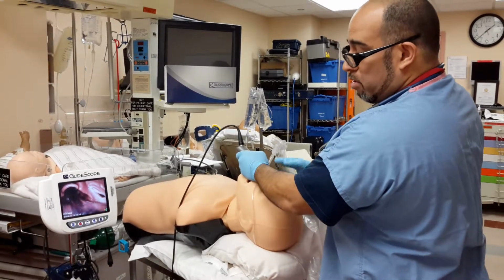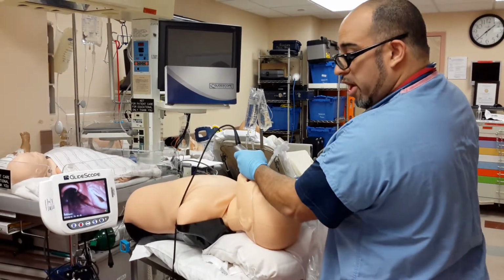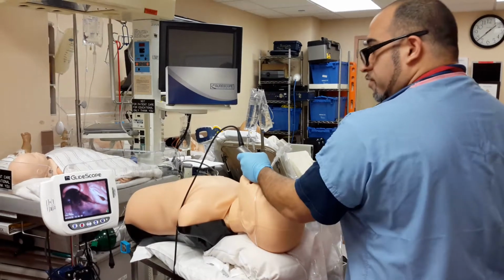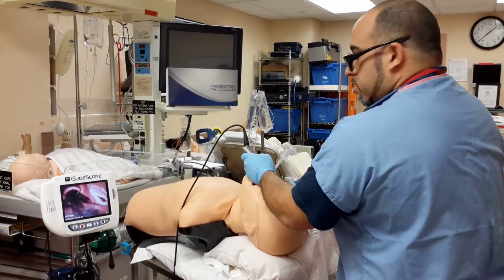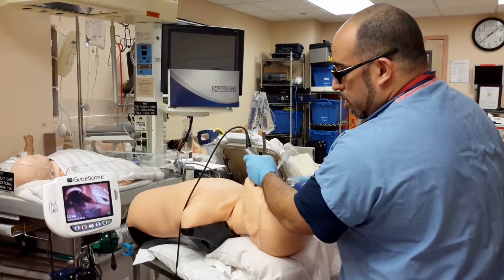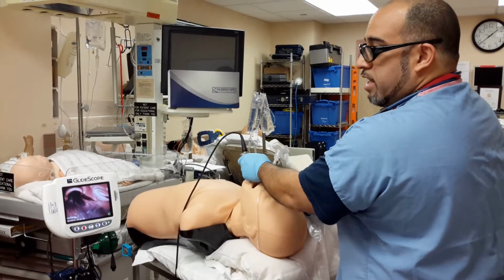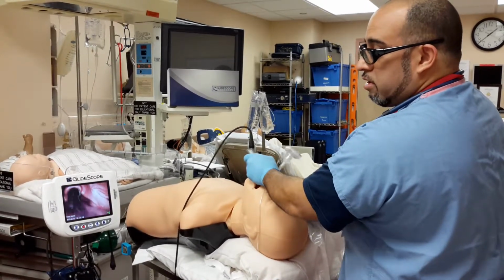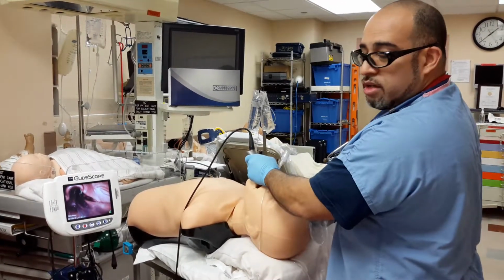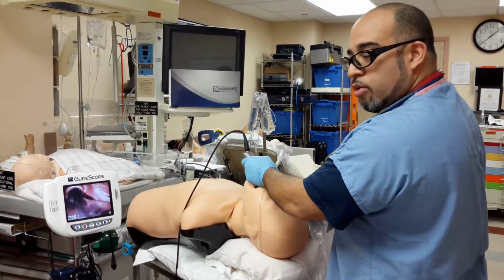Okay? Remember, your technique should not change how you intubate. It shouldn't be rocking. It should be forwarding your hand forward. Right? Using my arm as a lever, I'm comfortable and I'm intubating. I know what's going to happen though is novices who try to intubate with this are not supervised correctly and no one pays attention to the teeth, they are going to use this the way that they've been using when they can't intubate correctly with a Mac blade. Rocking. Teeth will be broken or chipped, and that's not the way the product was designed. Okay? Even though I'm getting a better view doing inappropriate rocking, it's not the way you use this product.